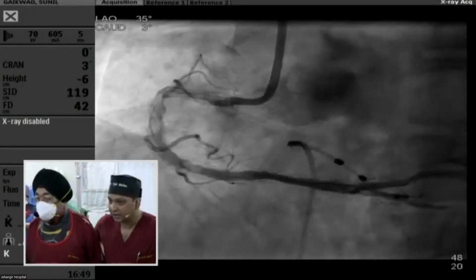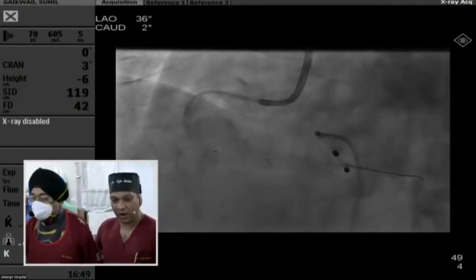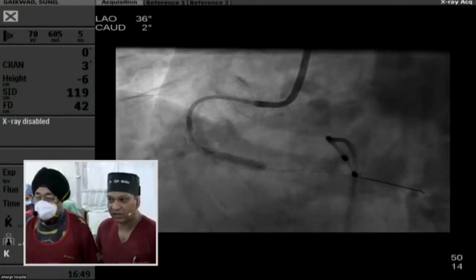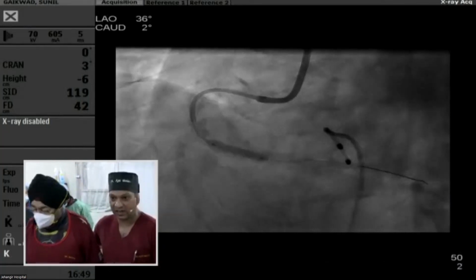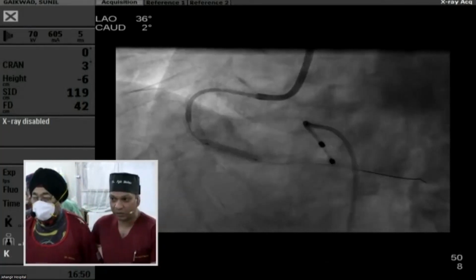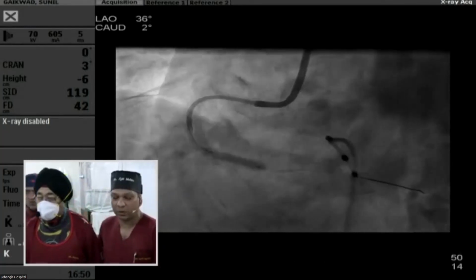So in fact, after doing 1.75 and doing high pressure balloon dilatation, we had to take guide plus 2 to deliver all the gadgets, even balloon, even stent and everything. And that's what we thought. IVL tracking down across this calcific artery would have been difficult. So we avoided doing an IVL in this artery particularly.